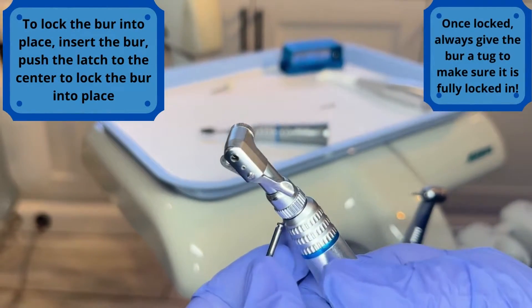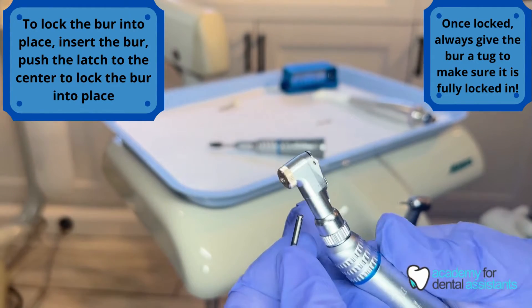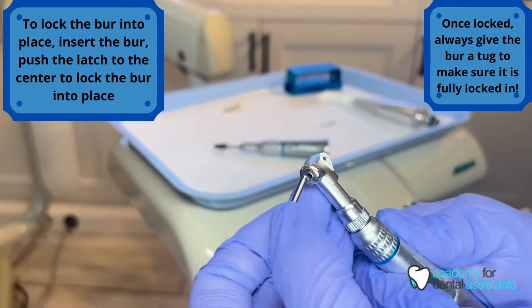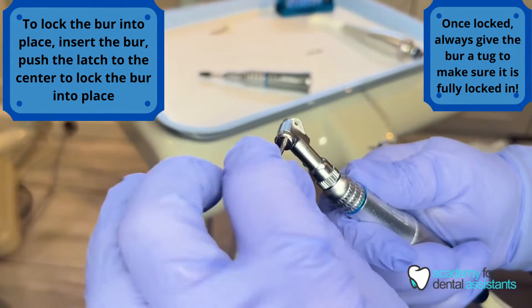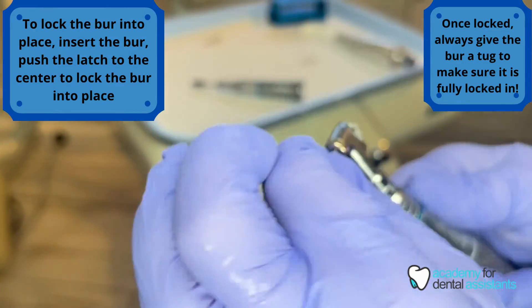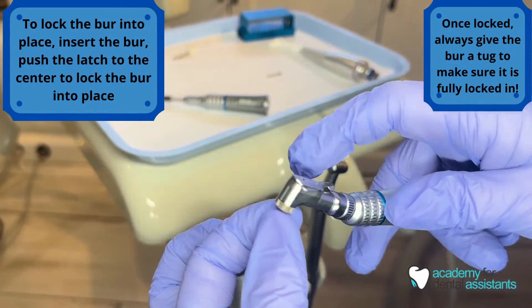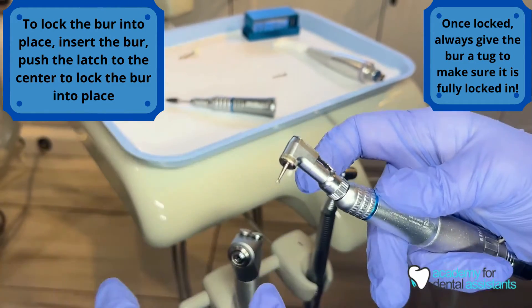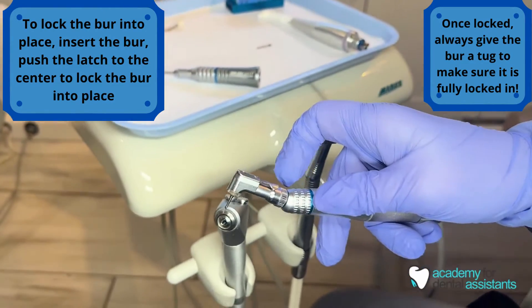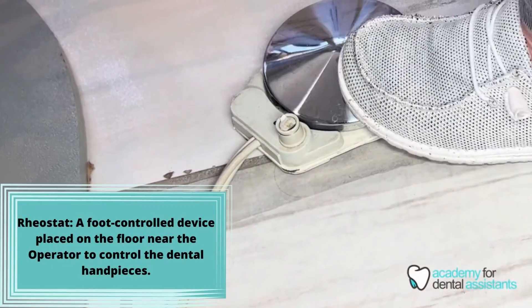The back of the contra angle has the latch. The latch is in the open position when it is to the side. Insert the latch-back burr and make sure it locks into place — you'll feel it slip in. Once it's in, slide the latch in the back to lock it in place. Always give it a nice tug to be sure that it is locked in.